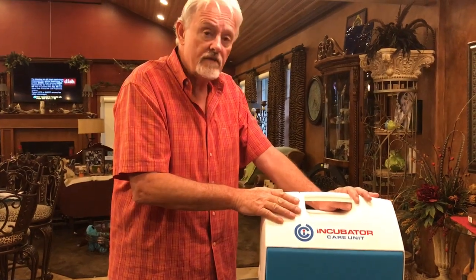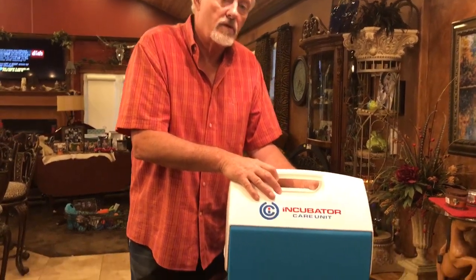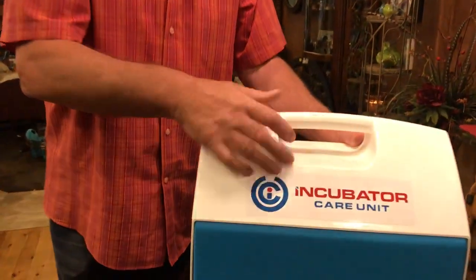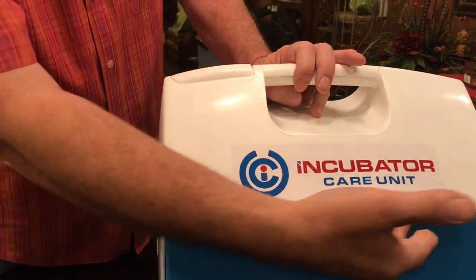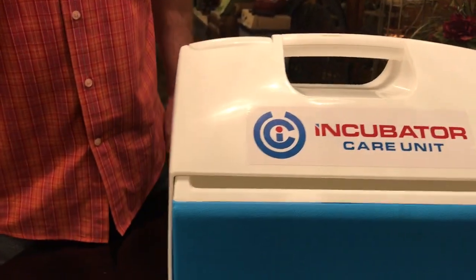We have saved puppies that would have undoubtedly not made it, that have been in one of these incubators for literally a couple of weeks until their eyes are open and they start to move around and they can move on their own steam. Of course, they will not suffocate in this either. There's enough air gap here that you've got airflow without having to do anything. But if you are worried about it, you can just crack it open. I always crack it open.